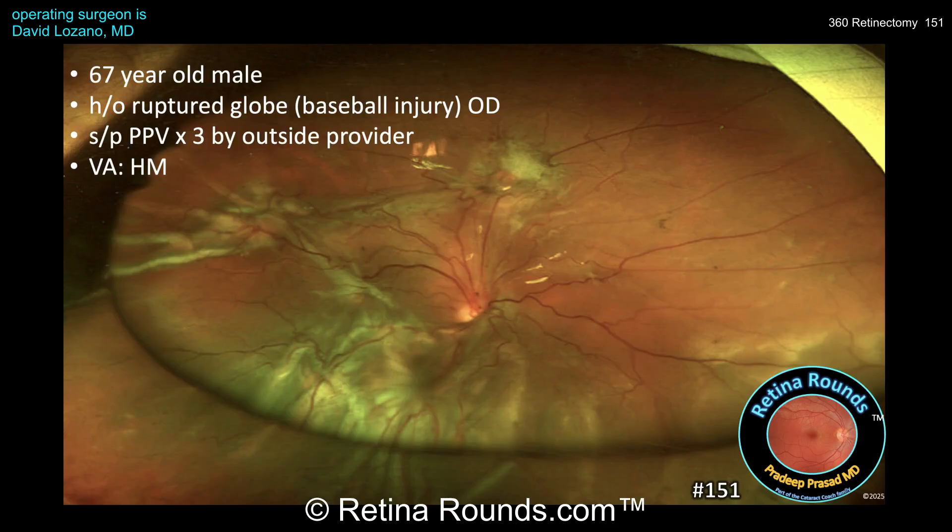The patient is a 67-year-old male with a history of right eye ruptured globe secondary to a baseball injury who previously underwent open globe repair and three vitrectomies by an outside provider for recurrent PVR-associated retinal detachment. The patient's vision is hand motions. There is an underfill of silicone oil, a funnel retinal detachment that appears narrow proximal to the optic nerve with retinal shortening and folding over the inferonasal edge of the optic nerve. There are diffuse PVR membranes that appear both pre-retinal and subretinal, and chorioretinal scars with surrounding fibrosis at roughly the 10 o'clock and 1 o'clock positions that may represent prior drainage retinotomy sites.